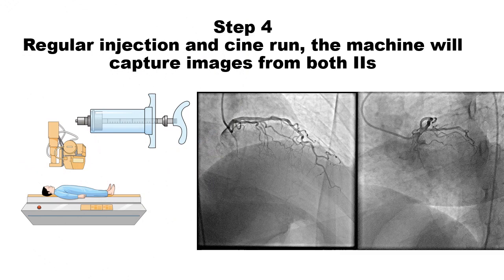Step four is just our regular injection and cine run, and the machine will capture images from both image intensifiers as we see here.